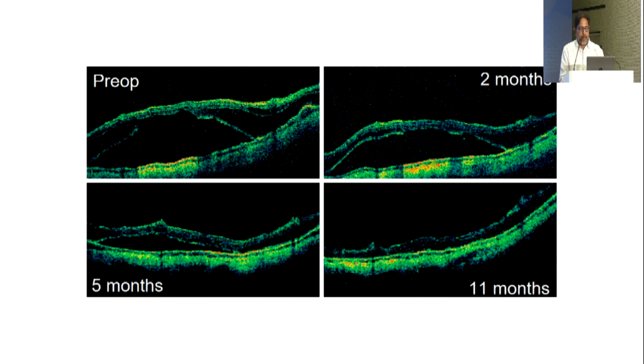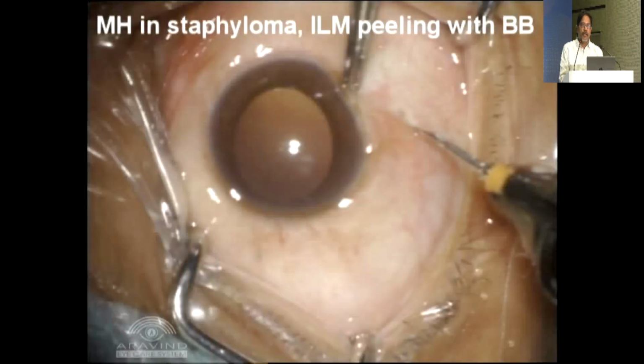In one more case, if there's a large subfoveal detachment in the absence of any break, the fluid can take a long time to resolve because of the absence of healthy RPE. The pumping mechanism is not very great, and it takes a long time for the fluid to come down.